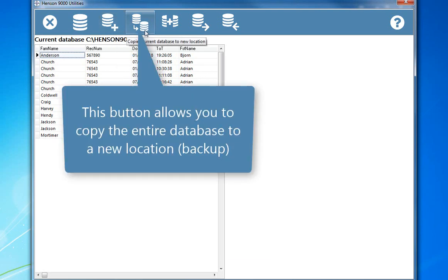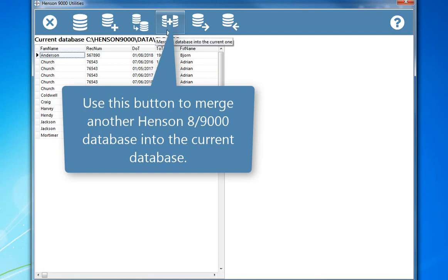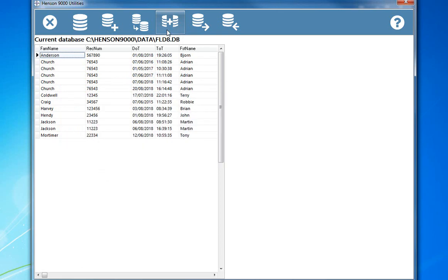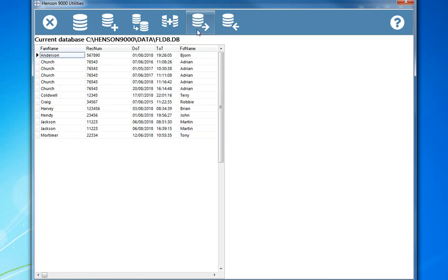This button allows you to copy the entire database to a new location, backup. Use this button to merge another Henson 8 or 9000 database into the current database. This button allows you to copy individual records to or from another database.